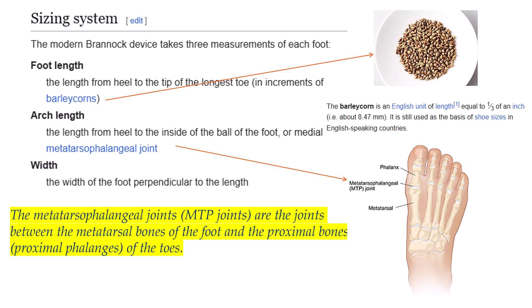Barleycorns are an old-school English unit of measurement. The US has a completely different measuring system, so the Brannock device is also available in the American unit system. The second measurement is the length from the heel to the inside of the ball of the foot — the metatarsophalangeal joint. The third measurement is the width of the foot, perpendicular to the length.